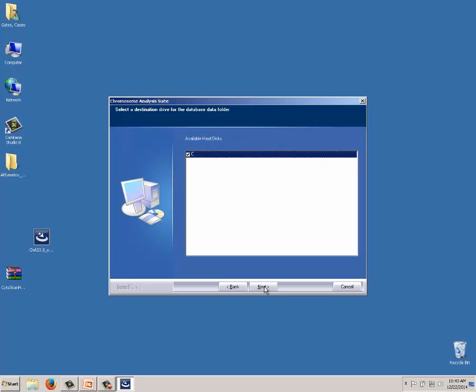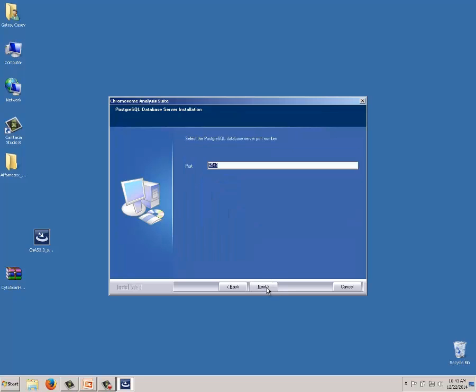It asks which hard drive to install on. If you have a partitioned computer with a C and D drive, select the drive with the most space. A general rule of thumb for database space: every thousand samples uploaded to CHAS DB requires about 1GB of space. I've selected C and clicked Next. The default port is 6543 — we recommend using the default. If you get an error that the port is already in use, contact your IT department to find a free port.